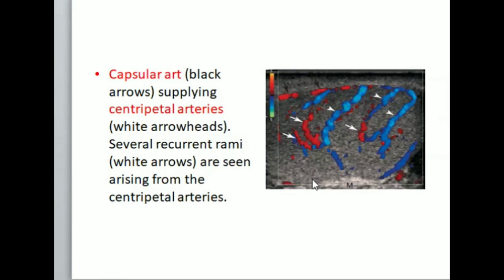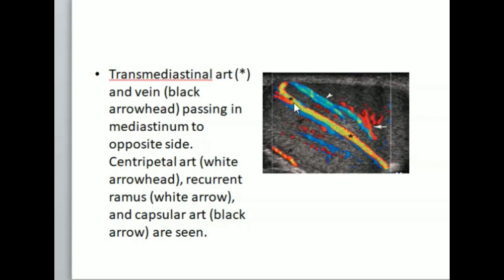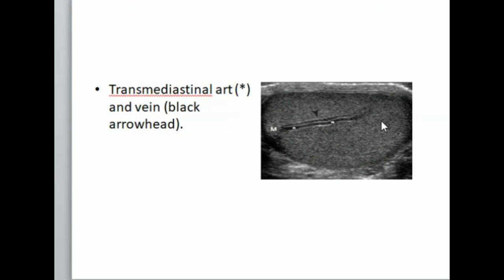This is the capsular arteries. These are the centripetal arteries taking branches from the capsular arteries. And these are some recurrent rami from the centripetal arteries. These are the arteries lying in the mediastinum, and other arteries can also be visualized. These black and white vessels visualized in the mediastinum are called transmediastinum arteries, which are lying within the mediastinum.